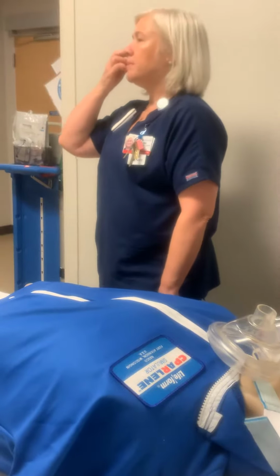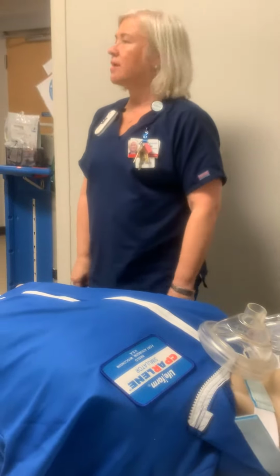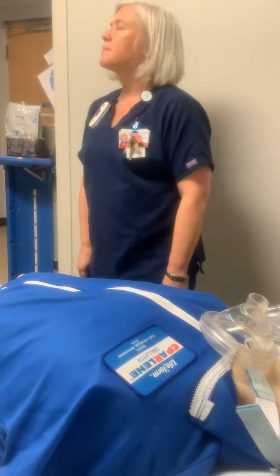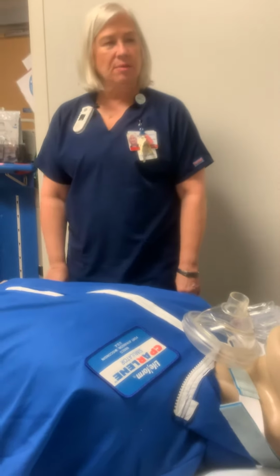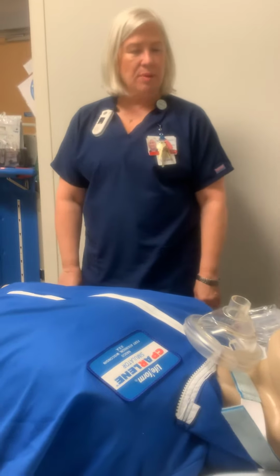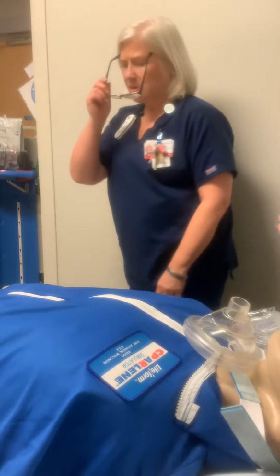So we don't do the patient any service though, like elevating their head or any of that in this scenario. Just leave them. We get a sat, fine. Just put an O2 sat on them so we can monitor that. Absolutely. Okay, and then one of us will come in and re-put the trach back in too, okay? Okay. All right, so, go ahead.